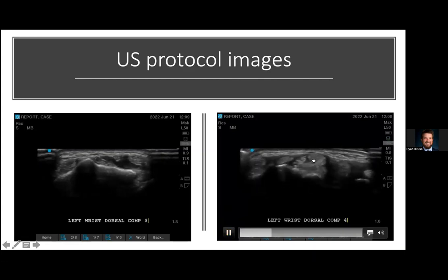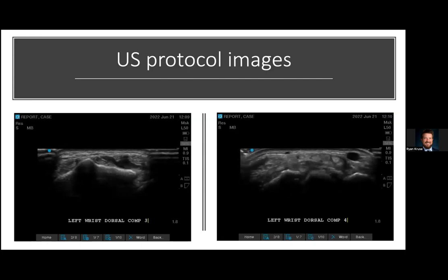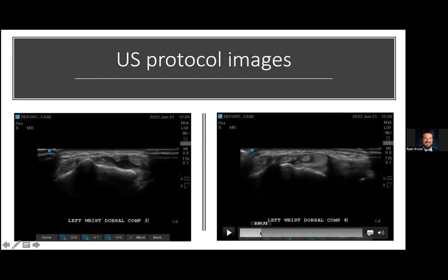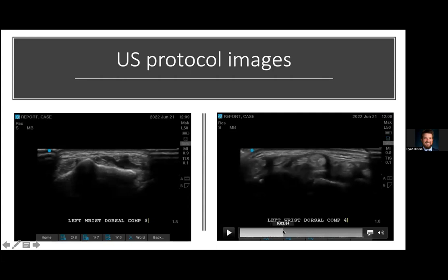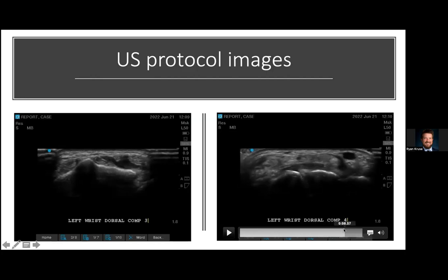The fourth compartment is probably the easiest to find because you can wiggle all those fingers to see them move. You have your extensor indicis and your extensor digitorum within this group. To isolate them from each other — since they're in the same compartment but do have separate sheaths — you can passively flex and extend the patient's finger to see mobility. As you move distally, you will see the individual tendons start to branch off into their respective sheaths going distally to each phalanx. You can start to see them separating.